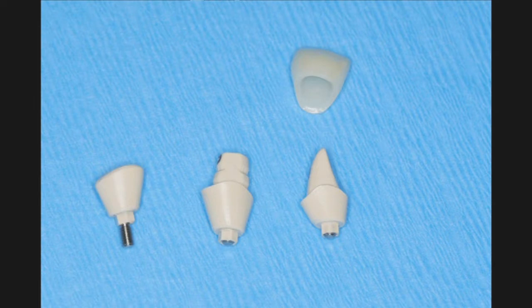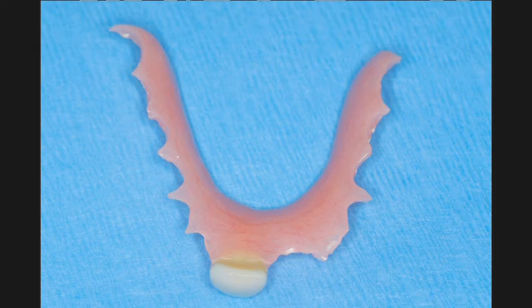impression coping were fabricated along with the biotemp provisional crown. Now, very important to realize that it's possible in a periodontally involved area, tooth extraction area, that we may not be able to torque that implant appropriately, and we would not necessarily immediately load the area. So a flipper type appliance was also fabricated, which again gives me a little safety device. If I didn't feel the implant was torqued, nor should it be immediately loaded, I could put the custom milled healing abutment in place and then use the flipper type appliance to replace the missing tooth.